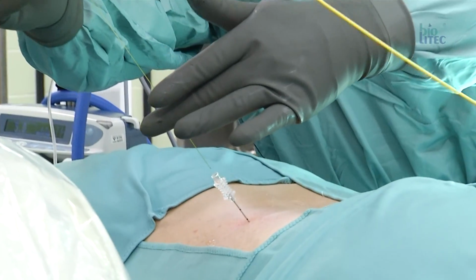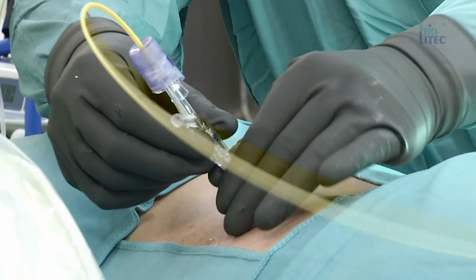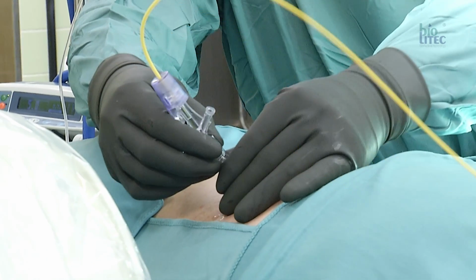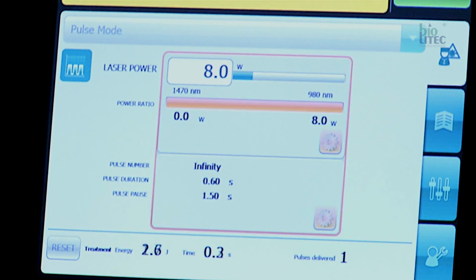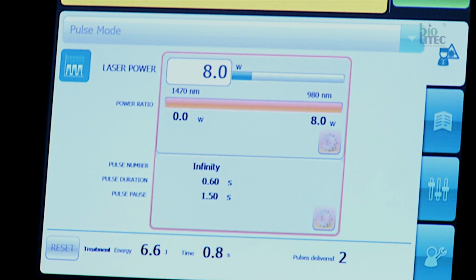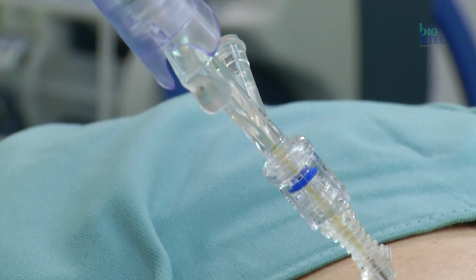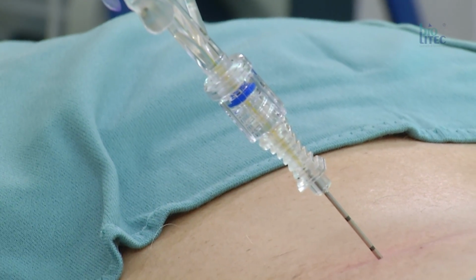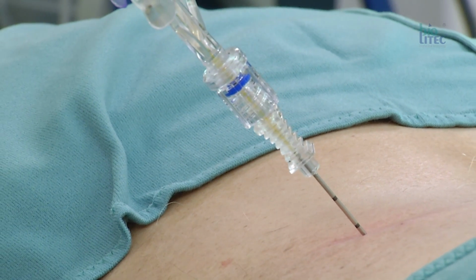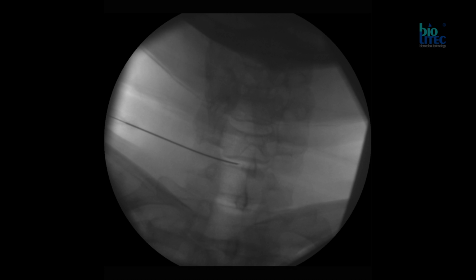After the correct needle placement, the glass fibre is inserted. The fibre overlaps the tip of the needle by 2 mm. After adjustments, the laser is started in pulse mode. For the cervical spine, I use a 20G needle and an anterolateral approach.